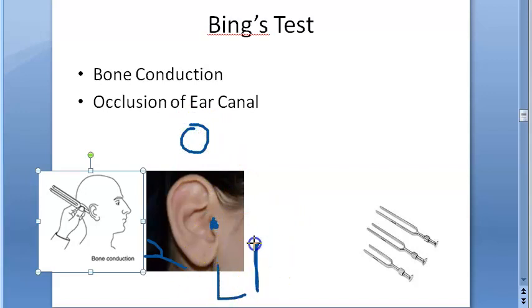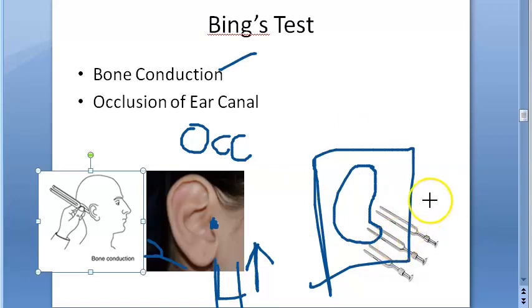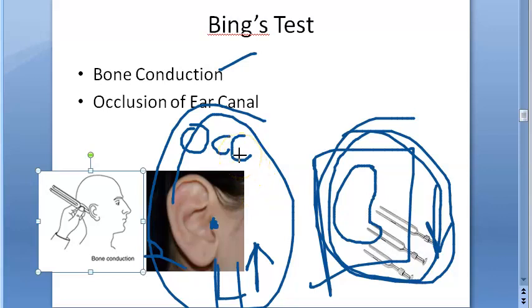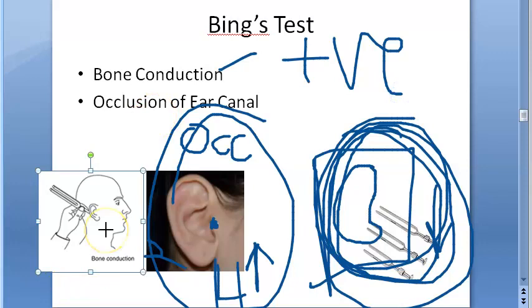When the ear canal is occluded, normal people will hear better, because you are checking bone conduction. When the occlusion is removed and the canal is free, the hearing is less — this is in normal people. This is called Bing's positive. When occluded, bone conduction hearing is better; when not occluded, hearing is less. This is a positive Bing's test, and like some other medical tests, positive here is good.